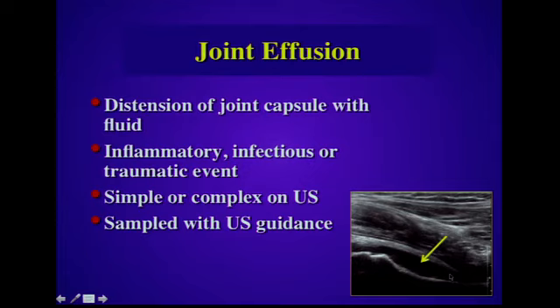Many times we'll see distension of the joint capsule with fluid. This can be due to an inflammatory, infectious, or traumatic event. And of course, if we're concerned about infection, we can use ultrasound to guide needle placement to sample the fluid.